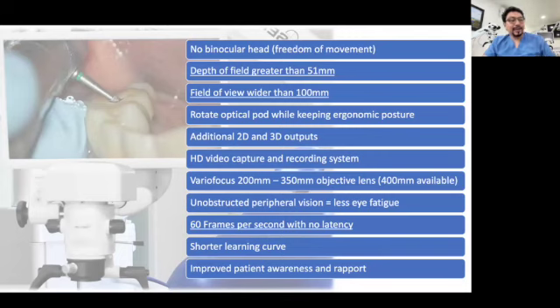And nowadays, guys, having a 3D microscope will make you different, will make you have a unique clinical practice, because nowadays it's not common. If you have dentists in your area and you have the 3D microscope, you can advertise yourself as a 3D microscopy dentist. And it's a very nice show for the patients. When I see young patients, for example, I invite the parents to come. I give them the 3D glasses, and I just let them see in 3D what I am doing. And for them, it's shocking. It's like, wow, this is so nice. I have never seen this before. So it's good for advertisement as well.